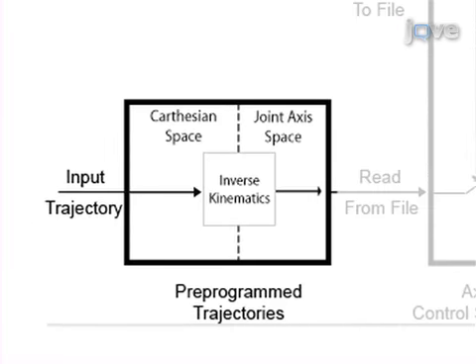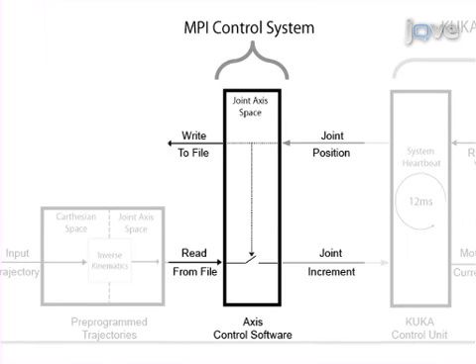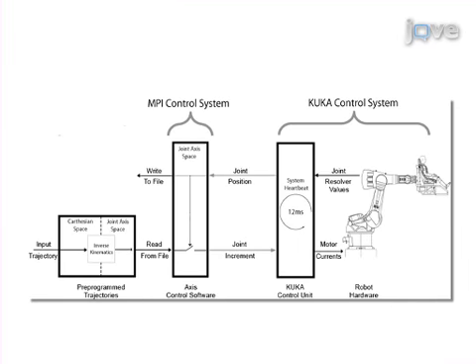Trajectories are programmed using a KUKA-designed Office PC to configure the MPI Cyber Motion Simulator. In this open-loop configuration, trajectories are put in Cartesian coordinates and are converted to joint space angles through inverse kinematics. Every 12 milliseconds, the current joint angle positions are transmitted from the control system to the MPI Cyber Motion Simulator via an Ethernet connection, where they are incrementally read and recorded to disk.